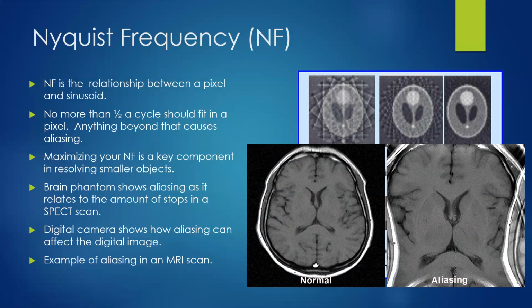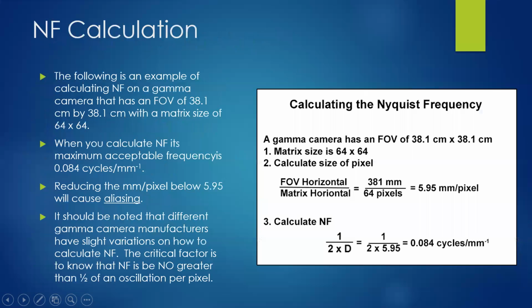And then, what I said is, let's find some other information out there other than nuclear, because I really couldn't find a lot. And here's an example of an MRI scan. So an MRI, this looks normal. What they did here is they applied aliasing. And what I want you to note is up here is missing, and down here is popping into it. So the front of the skull is pushing into the bottom of the skull, or I should say anterior is coming into the posterior realm.